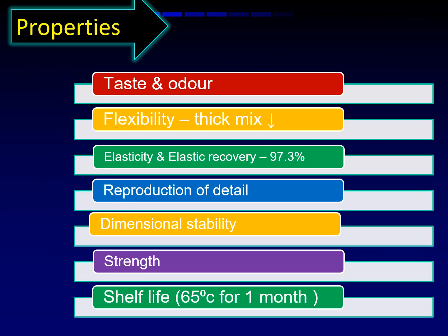The properties are it has no taste and odor. It is a flexible material. It has elastic recovery of 97.3%. It reproduces the details. It is a dimensionally unstable material. It has less strength. The shelf life is 1 month at 65 degrees centigrade.